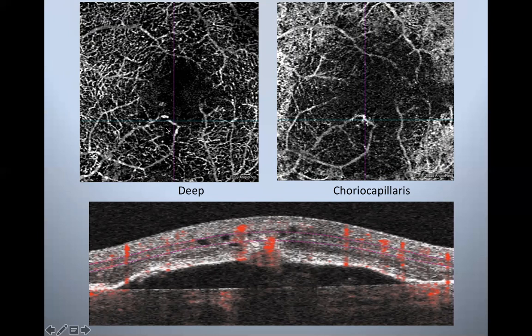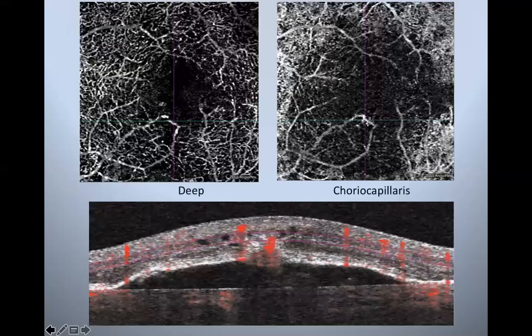So this tells me it's coming from above. Plus the B-scan on the bottom is really a brilliant example of a RAP lesion. You can see that the Bruch's membrane on the bottom is fairly intact. There's RPE fluid underneath there like we saw. And this bright red you see in the middle here is that RAP lesion that's coming down.